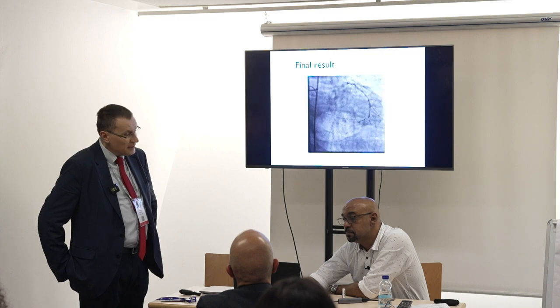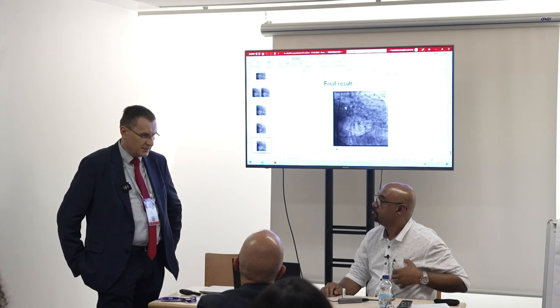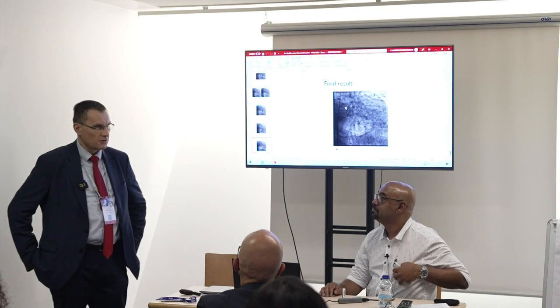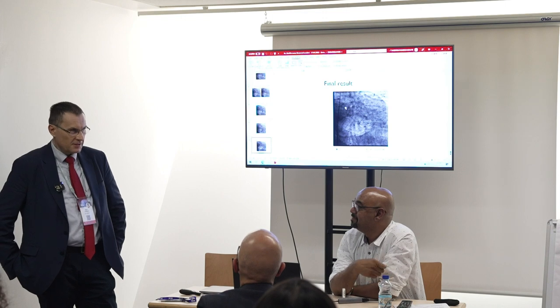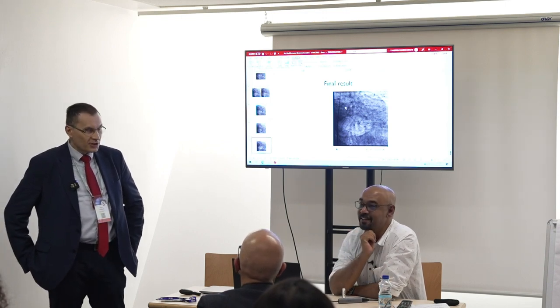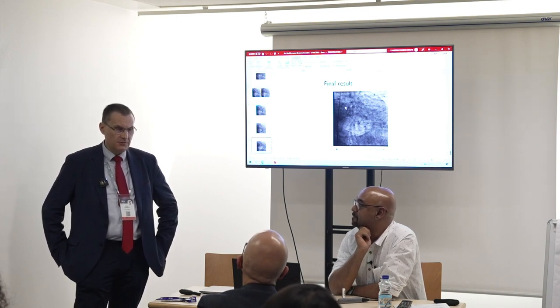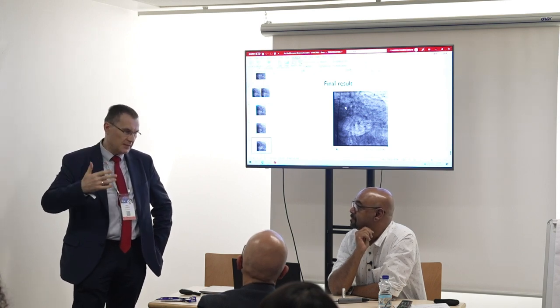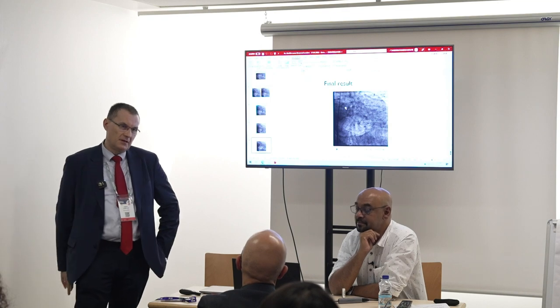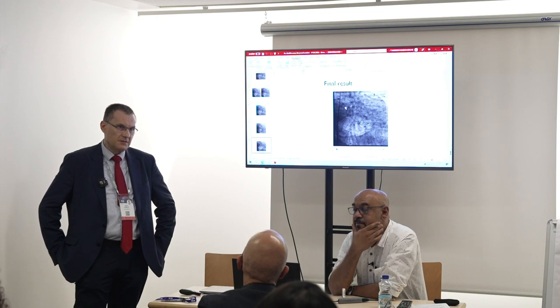So these are my cases. Just the second one was pretty devastating at the time of procedure when you cannot cross the lesion with the rotablator. Afterwards, the internal feeling is not very good. But Alveo is a really very good balloon, and it just crossed. Probably it was facilitated by the half rota anyway. But in any case, it resolved the case.